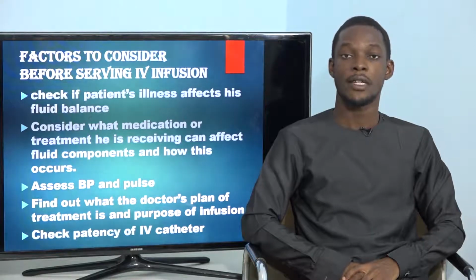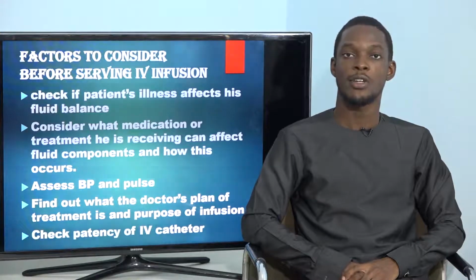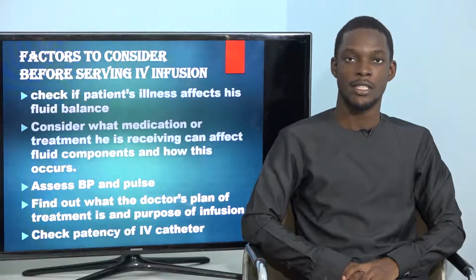Next, you are supposed to find out the doctor's plan and the purpose of the infusion. And subsequently, you are supposed to assess for the patency of an IV catheter, or what we call a cannula, prior to administering an IV infusion.